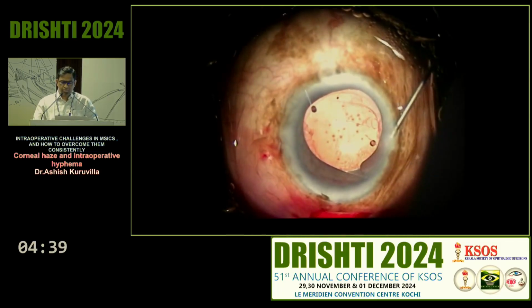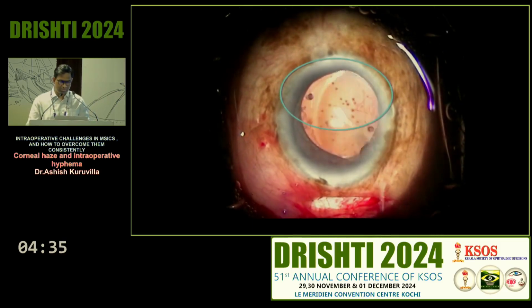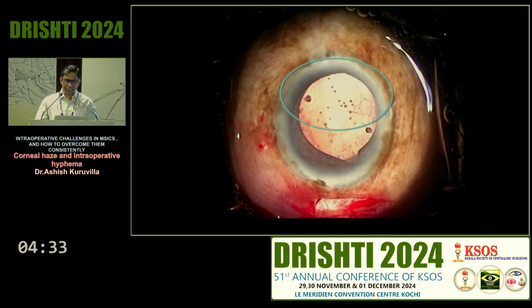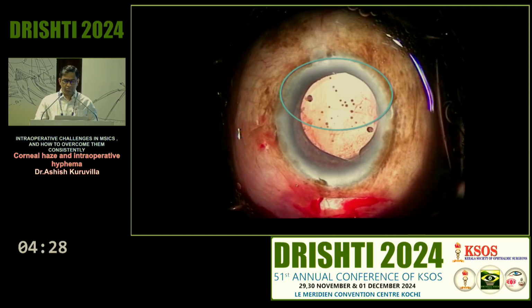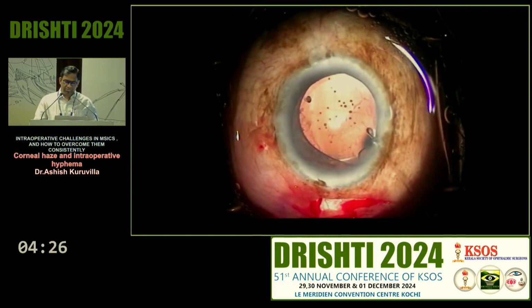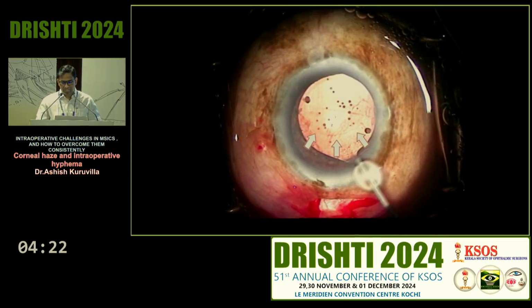And so you must remember that these corneal degenerations are predisposed to Descemet's detachment also. So always you should pay more respect, even when you're doing small steps like introducing instruments, exiting instruments, hydrating. You have to be very, very careful because you can easily end up with a Descemet's detachment. Even in the last step of the surgery, you can end up with a problem like this.